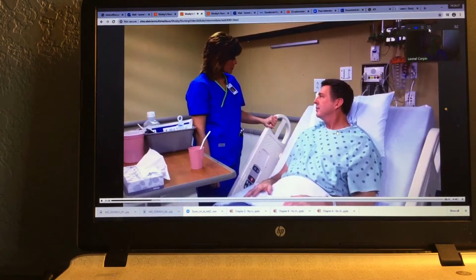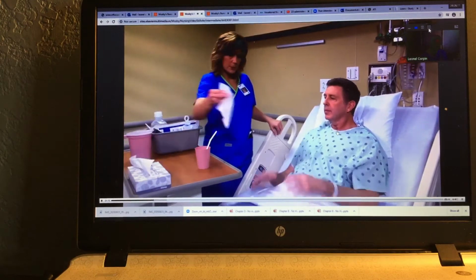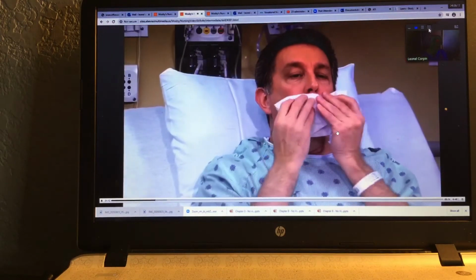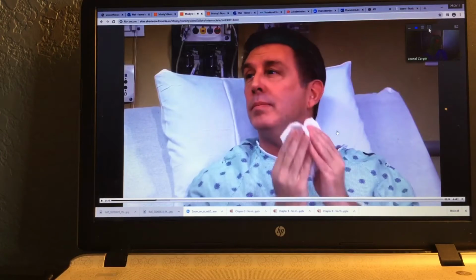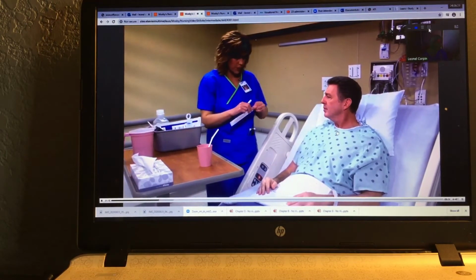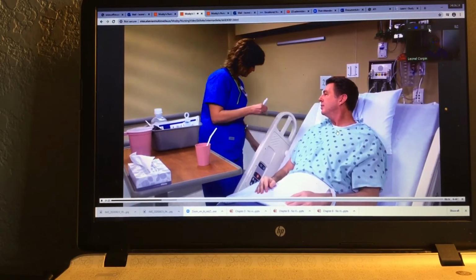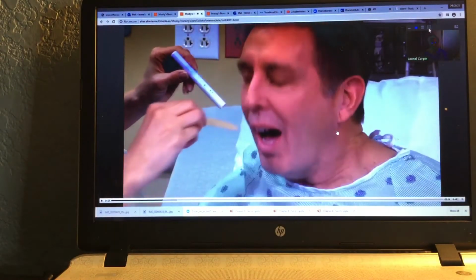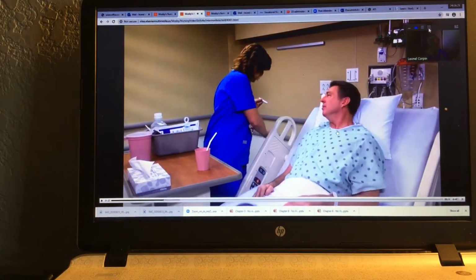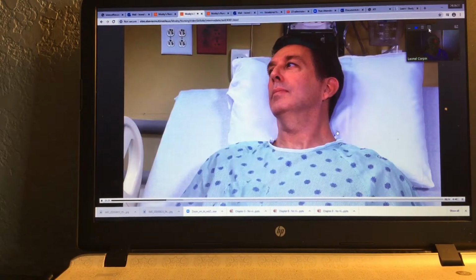All right, I'm going to assess you for a few things before we get started. I would like you to cough for me, please. Very good. And then I'm going to assess your gag reflex. Thank you. Sorry for that discomfort. It's okay. I'm going to raise the head of bed for you now.